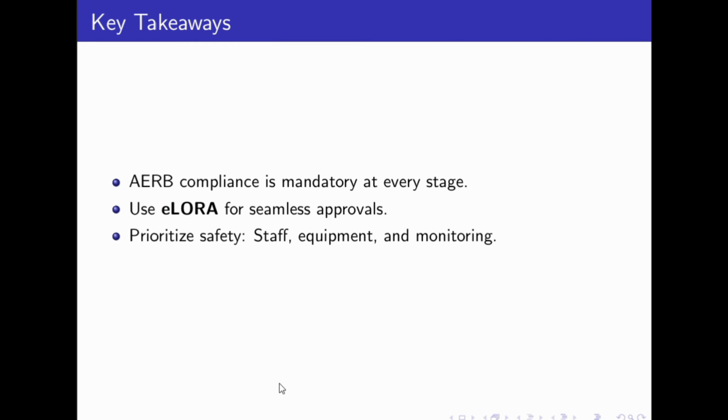The key takeaways are that AERB compliance is mandatory at every stage, every process step. You have to submit or intimate AERB by submitting an application through the AERB portal, and your institute has to prioritize the safety of staff in running a radiotherapy facility.